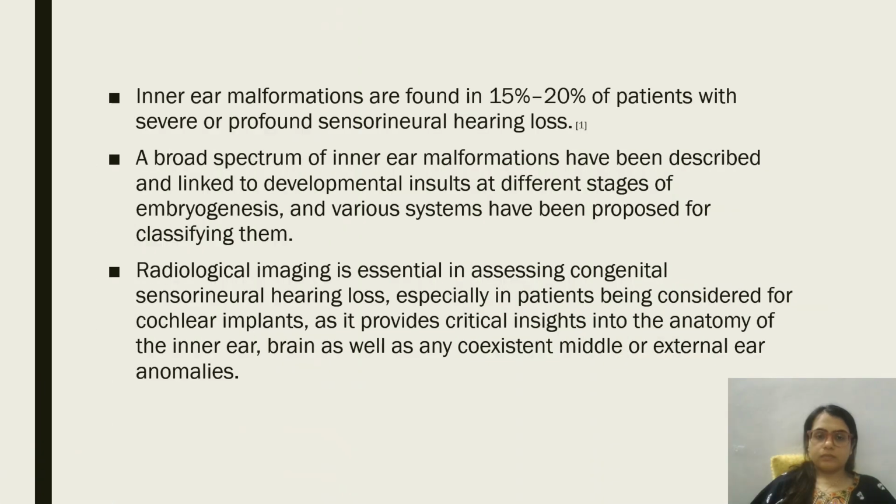Introduction. Inner ear malformations are found in 15 to 20% of patients with severe SNHL. A broad spectrum of inner ear malformations have been described and linked to developmental insults at different stages of embryogenesis, and various systems have been proposed for classifying them.